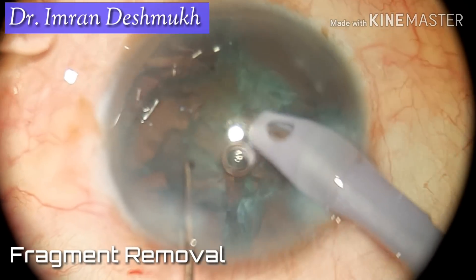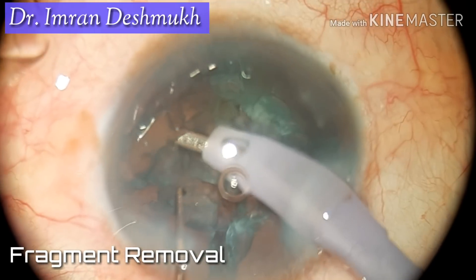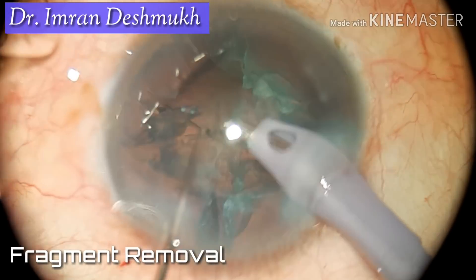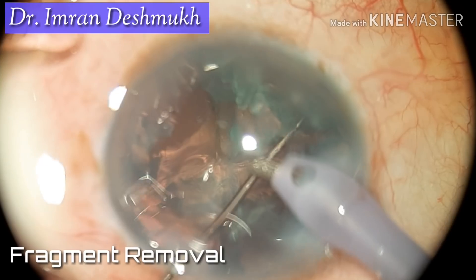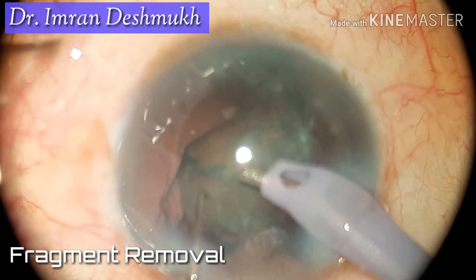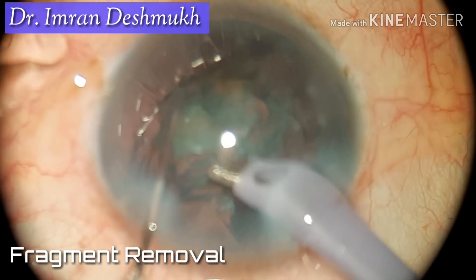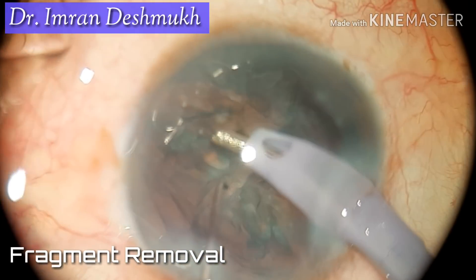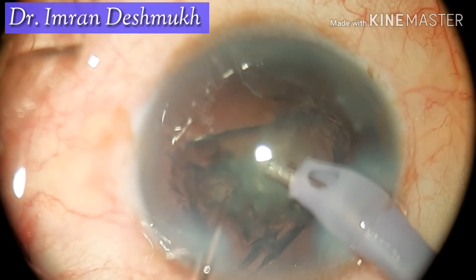Once you have partially widened all four quadrants, use vacuum and try to pull one quadrant. You'll see that each quadrant comes out — it pierces out through its trenched edges. After using a little vacuum, the whole quadrant comes out in its proper shape. Once one quadrant is removed, slowly use vacuum and pull the second quadrant, and it comes out very easily through its trenched edges.